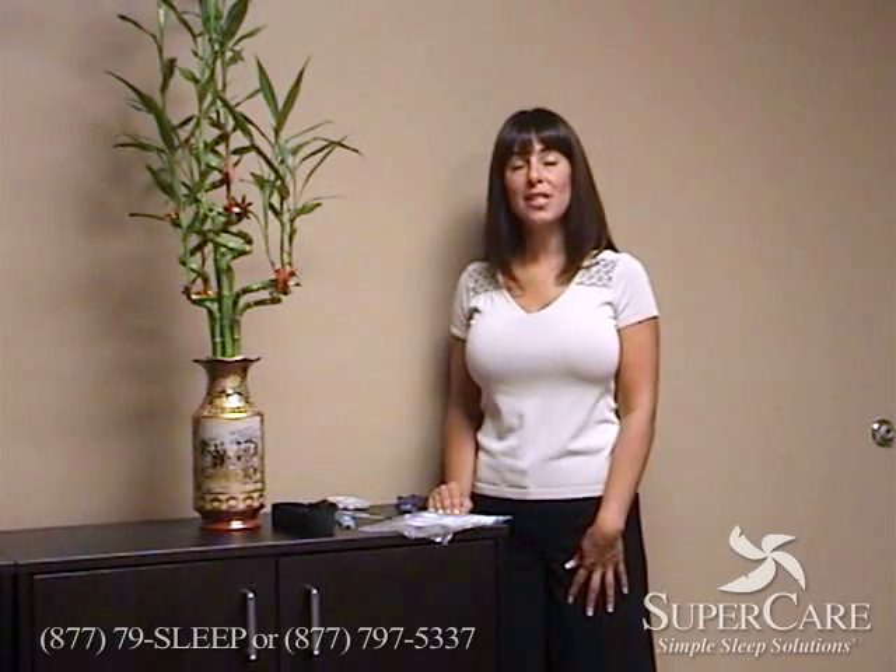Hi, I'm Jeanette with SuperCare. I'm going to show you how to do a home sleep study using the apnea link you received.